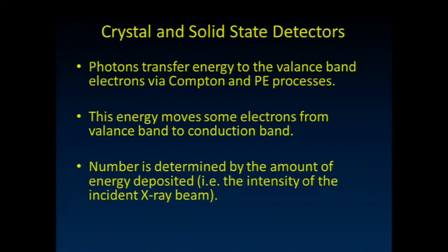That electron may immediately fall back down into its valence band and give off a little bit of electromagnetic energy in the kind of visible light range. And things that do that immediately, that return immediately and immediately give that light off, are called scintillators, right? And things which take a little bit more time to do that are called phosphors. So scintillators and phosphors are very similar things.